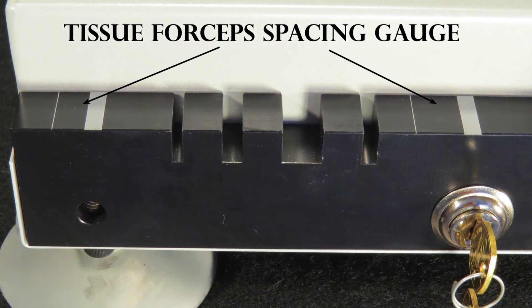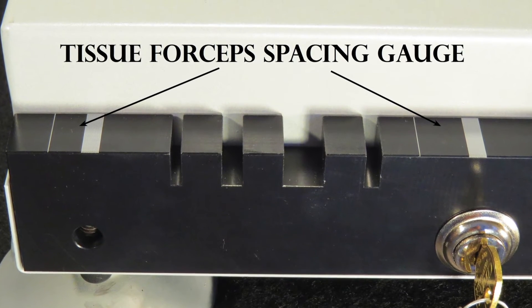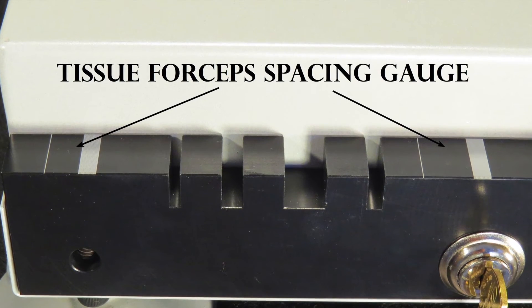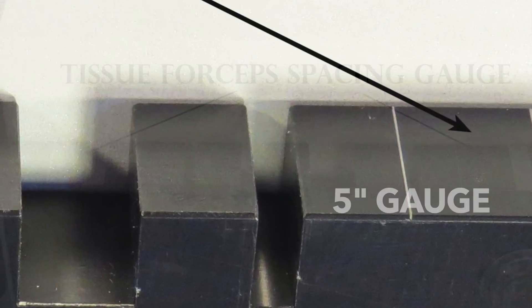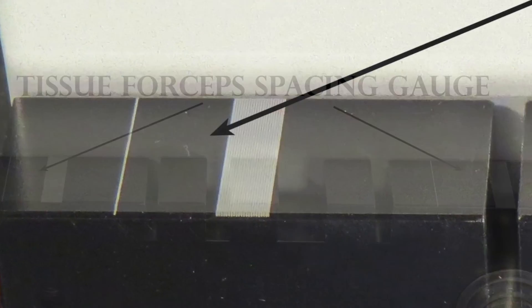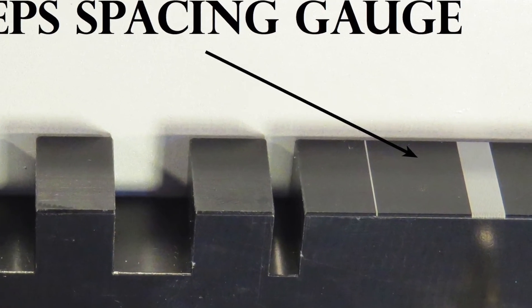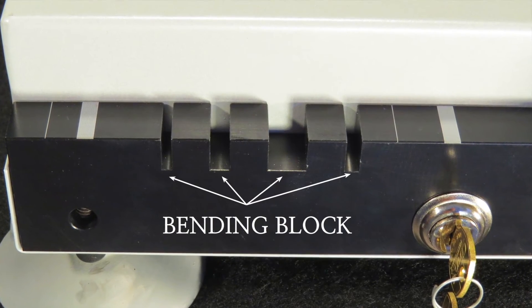Tissue Forceps Tip Spacing Gauge: These two gauges are used to quickly check the spacing between the teeth of tissue forceps with the instrument fully open. Note the position of the 5-inch mark on the top of the bending block. Tissue forceps that are 5 inches and shorter are to be measured on the left gauge. Tissue forceps longer than 5 inches are to be measured on the right gauge.